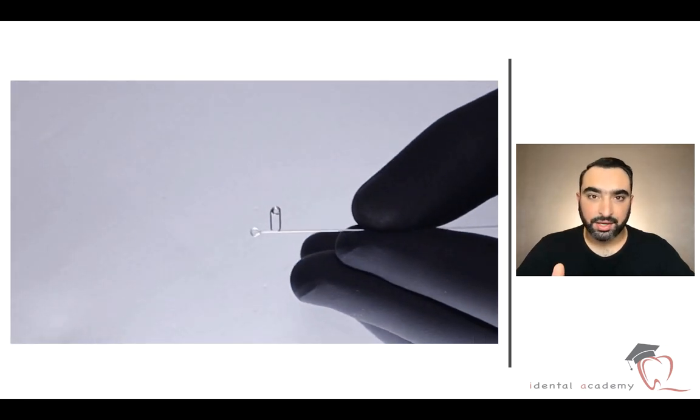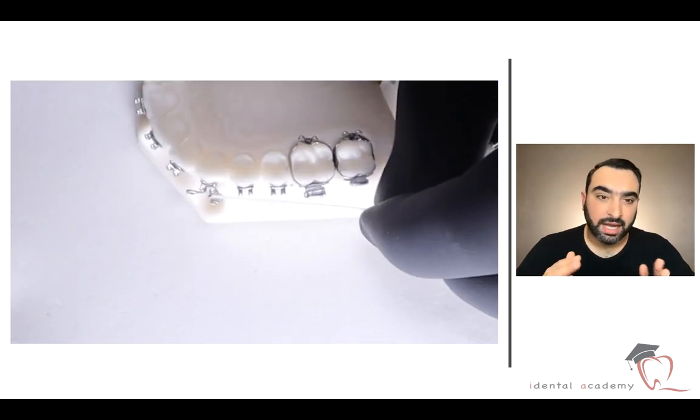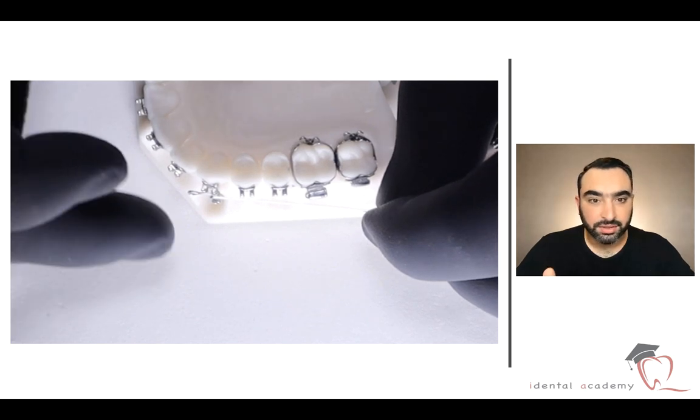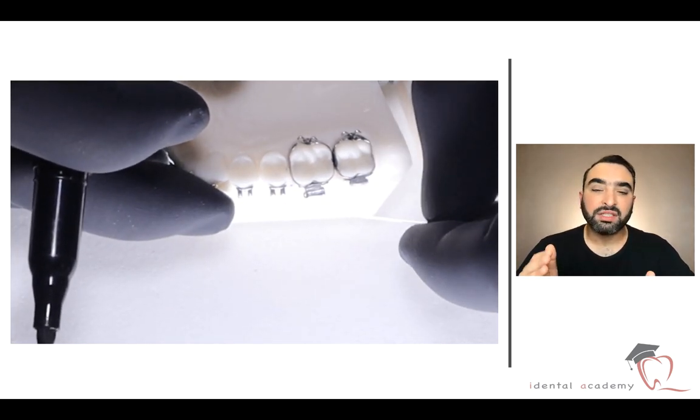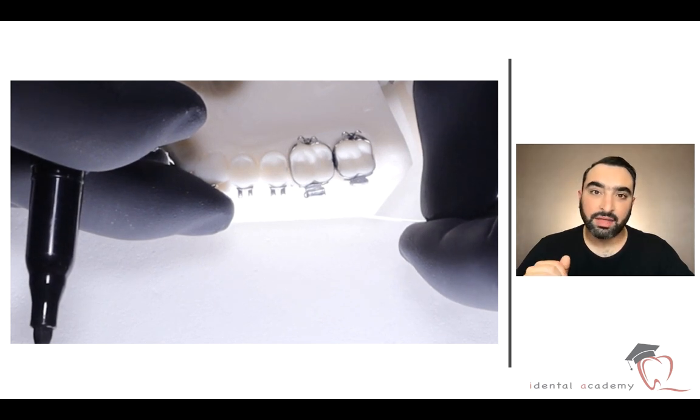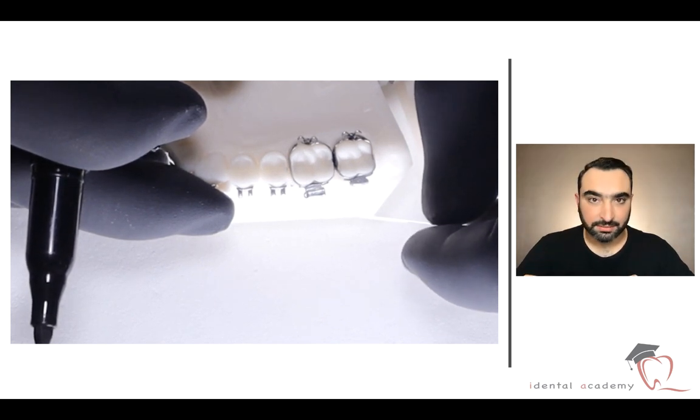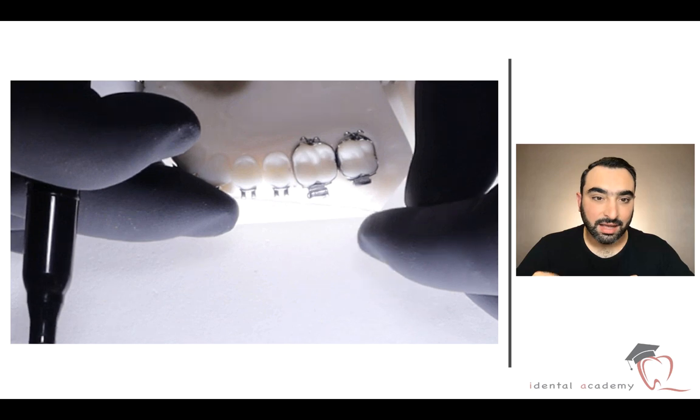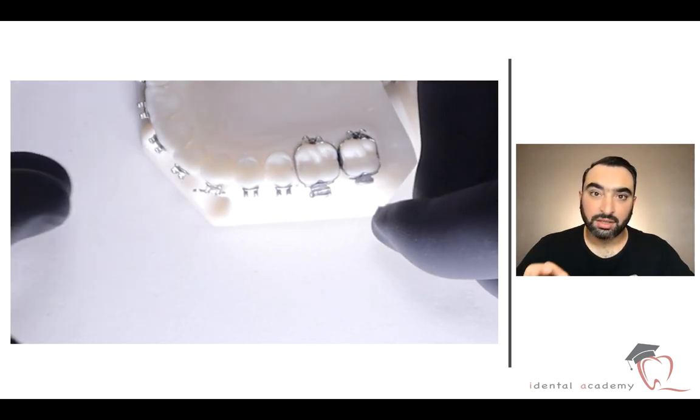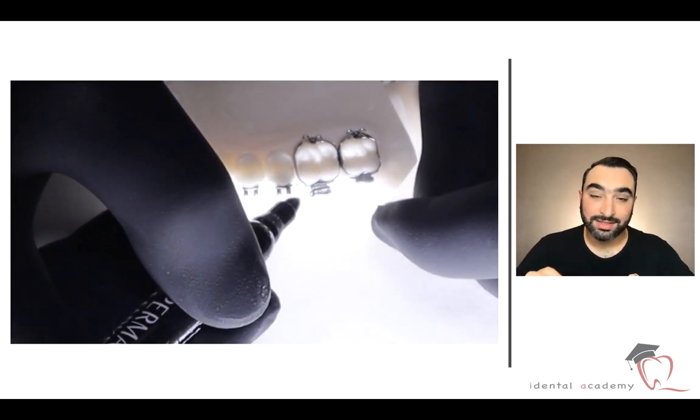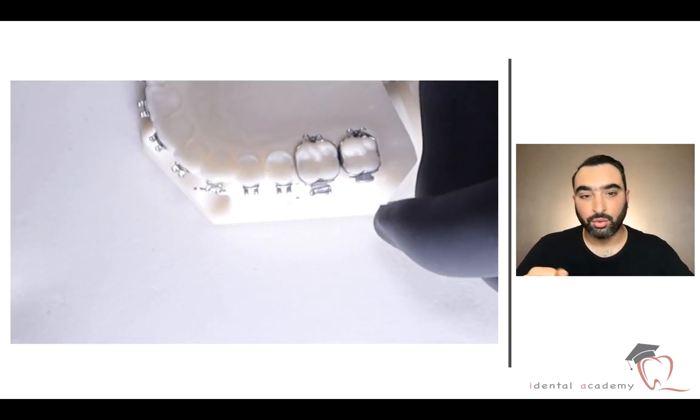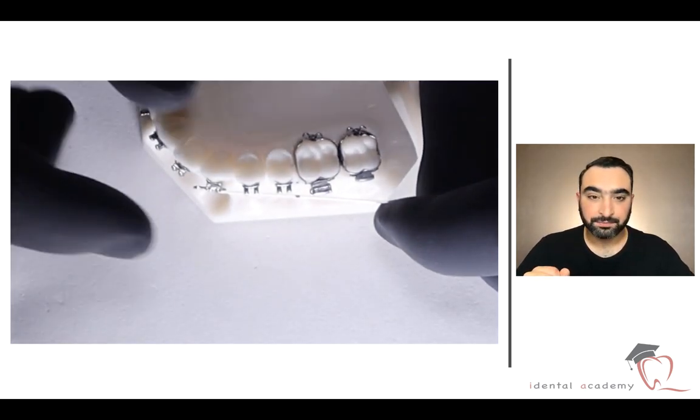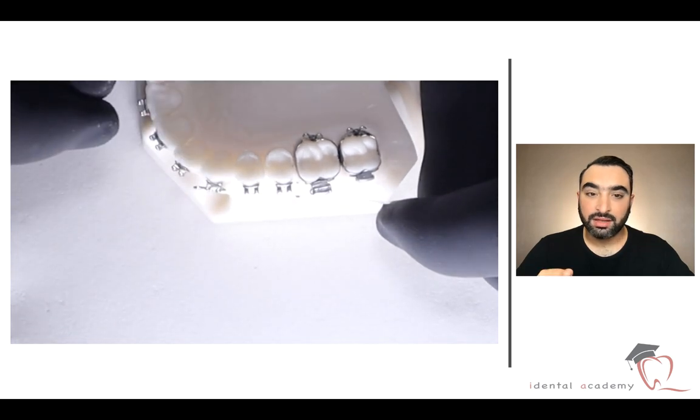Actually the sectional retraction wire has two parts: anterior part we already done, and posterior part. The posterior part starts after second premolar, mesial of the buccal tube or the band. Usually I use band with this kind of sectional retraction wire because it needs activation, and sometimes the buccal tube will be broken while you are activating.